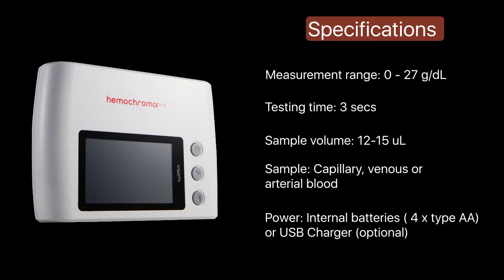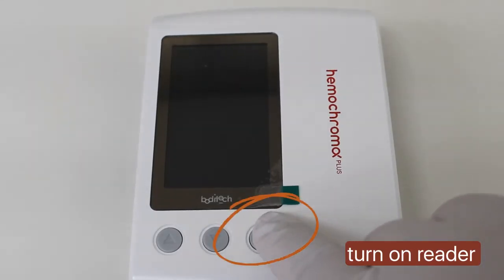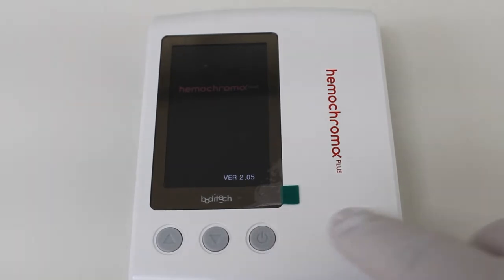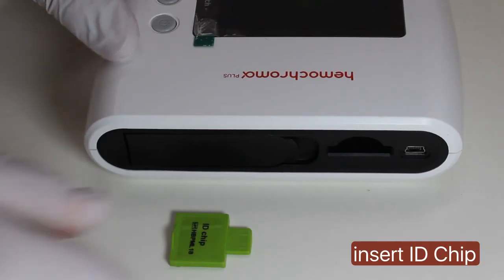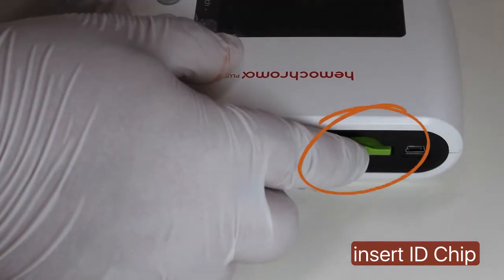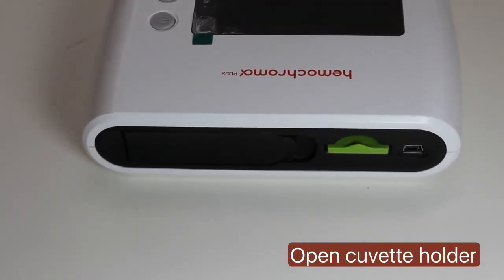Now, let's do a test demonstration. Quickly press the power button. Insert the ID chip provided with the micro-cuvet box. Open the cuvette holder to get the system ready.